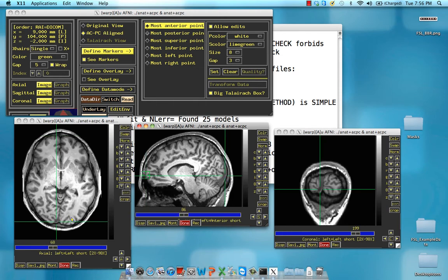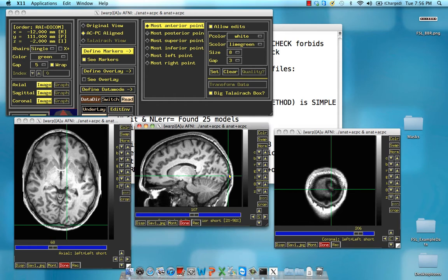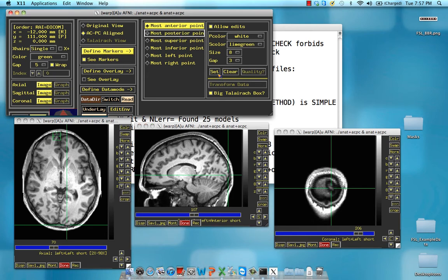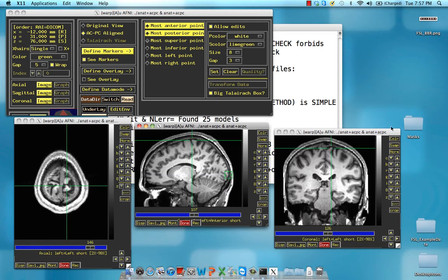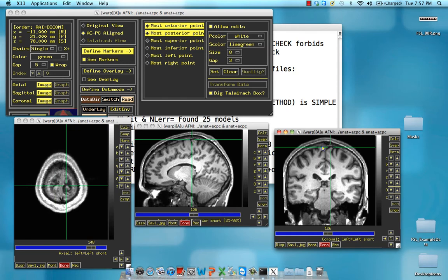Go to the very rear of the brain, and observe that the two hemispheres jut out at different lengths. In this case, the right hemisphere is actually farther back. Adjust in the sagittal plane — that's about the very end of the posterior point. Click Set. For the most superior point, go to the very top of the brain. Again, there's some asymmetry between the two hemispheres. Go with the rightmost tip on the right hemisphere, and click Set.